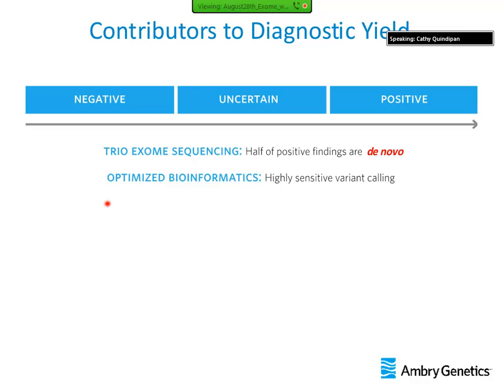We're also optimizing our bioinformatics with our highly sensitive variant calling. So we really are putting the onus on our clinicians and our clinical team to filter out alterations based on the clinical manifestations and the phenotype of the patients in the cases that are presented to us.